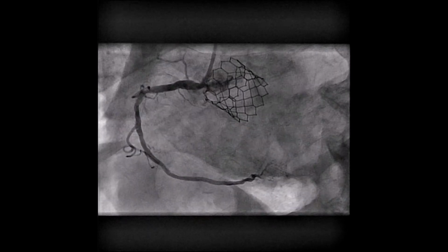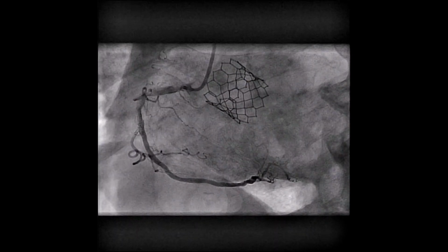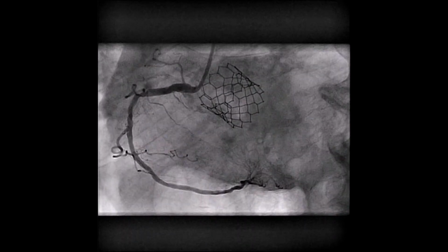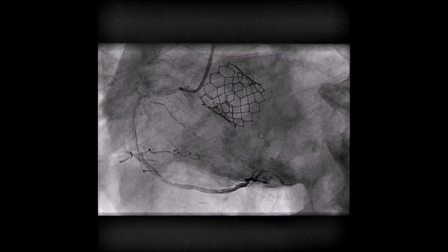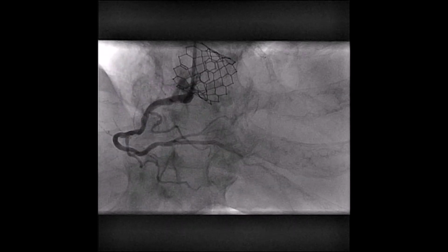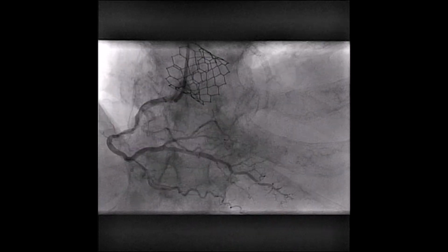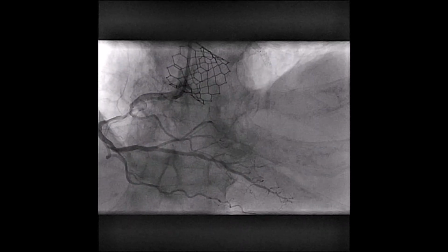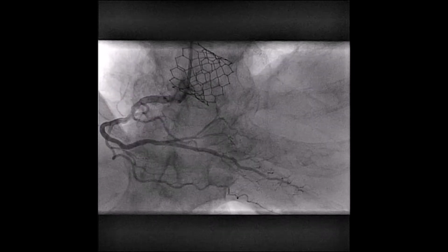In this case, a cardiac catheterization was performed, and, as you can see, there were no angiographically significant lesions in the right coronary artery. This is logical, taking into account that the electrocardiographic alterations were in the anterior wall. So we are going now to take a look at the left tree, but first, it is worth stopping for a moment to carry out an academic exercise.